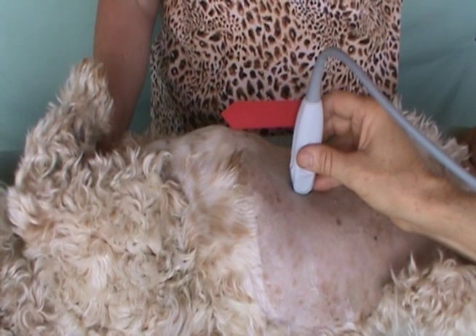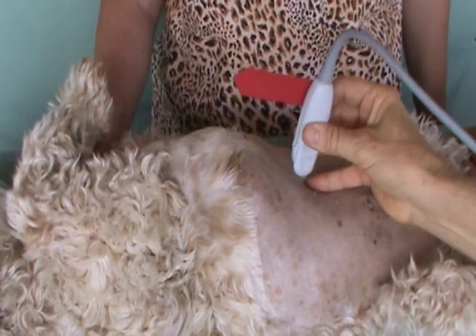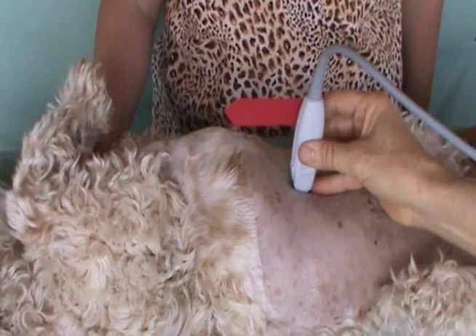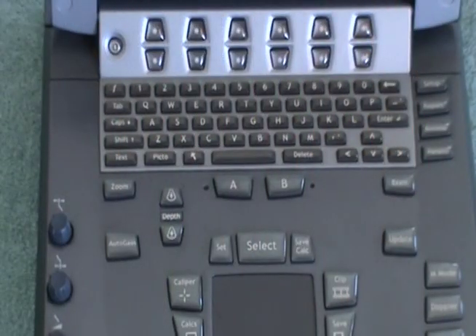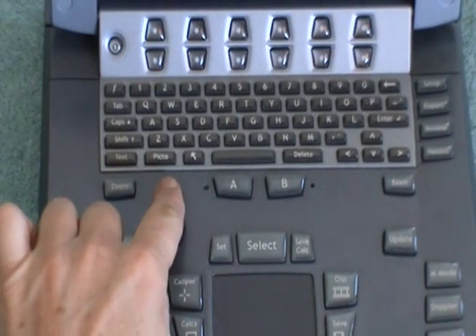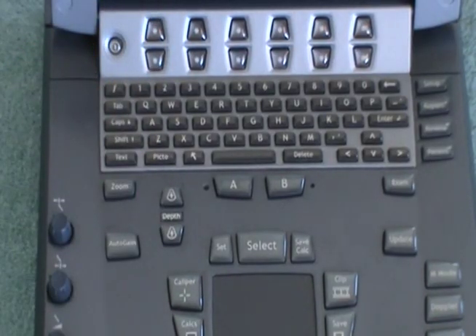In presenting this DVD, I am assuming the viewer is familiar with standard transducer positions and movements, as well as orientation of organs on the ultrasound screen as presented in the Tips and Techniques DVD. I also encourage the viewer to optimize the ultrasound image for your ultrasound machine as described in the Tips and Techniques and General Abdominal Scan DVDs.